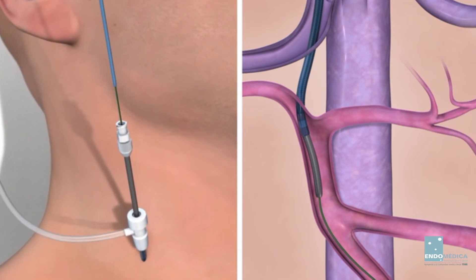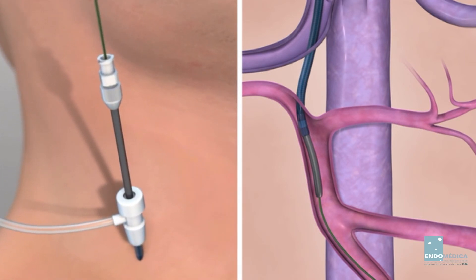Remove the 14-gauge support cannula and the 5 French catheter from the assembly. While maintaining access through the introducer sheath, you may remove or utilize the wire guide and 10 French catheter as required for further diagnostic or interventional procedures.